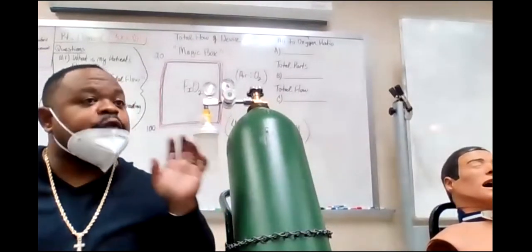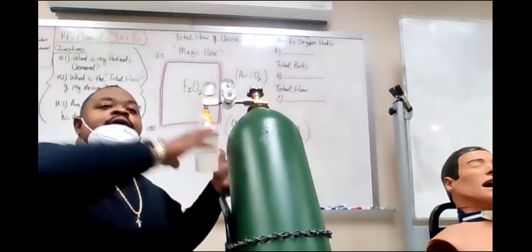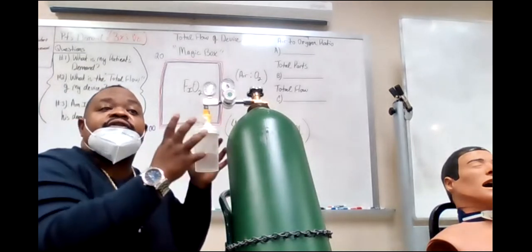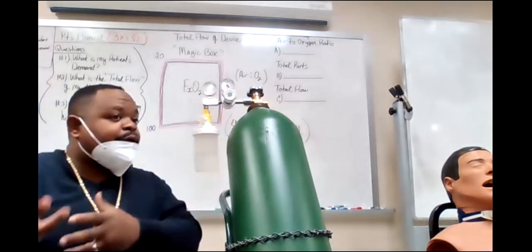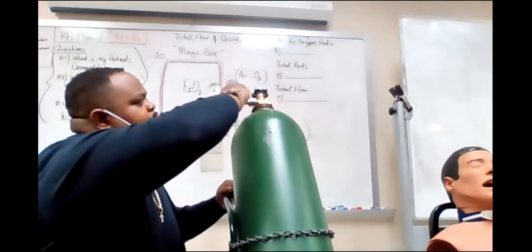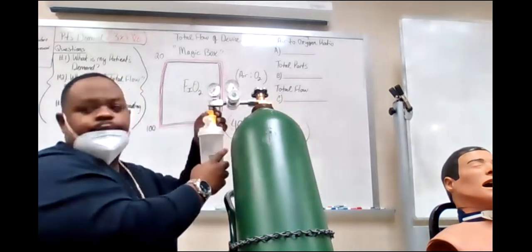So that is the first part of our high flow system, right? The Venturi system. Now this will be called an aerosol something, right? Whatever is on the end is what I call it. But because it's water, it's aerosol, okay? Now, Venturi can be either aerosolized or just regular. The first one we're going to talk about is just regular. Okay, so let me cut this back off. And let's talk about the Venturi setup, just the regular Venturi.